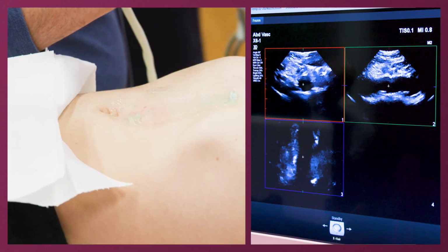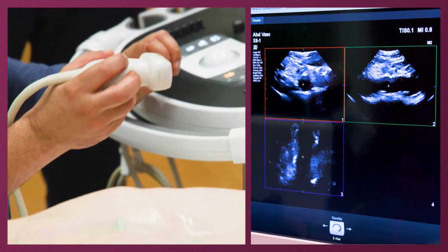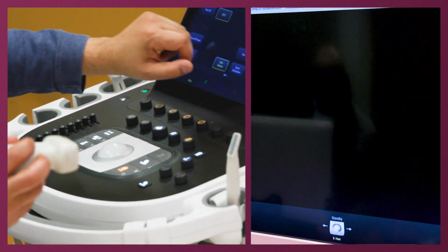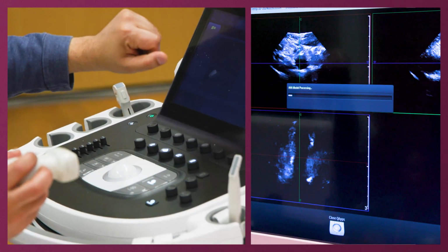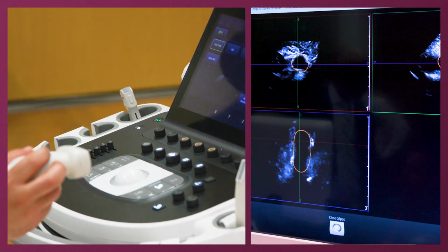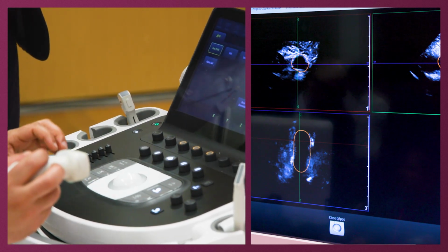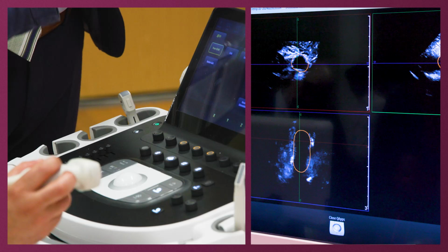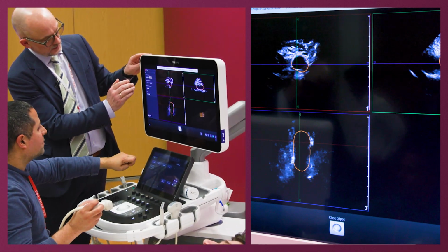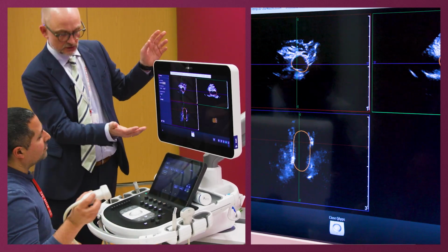Now you have these ABC planes. And you can push the AAA. So now it's trying to figure out if this is an aneurysm or not. I guess it gets not bad. So it's actually possible to do edits. It's native. So it suggests this one. Let's just say it's good.